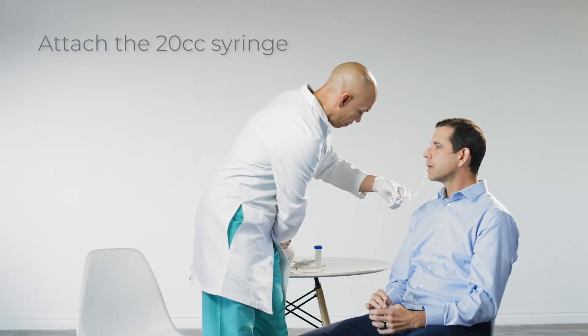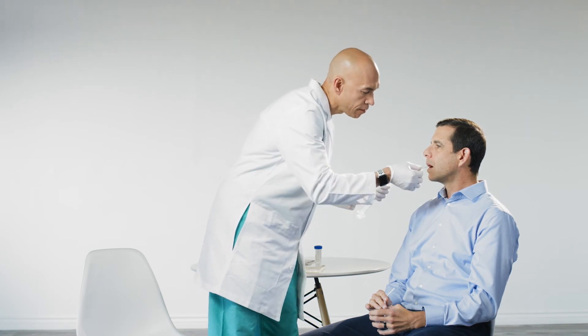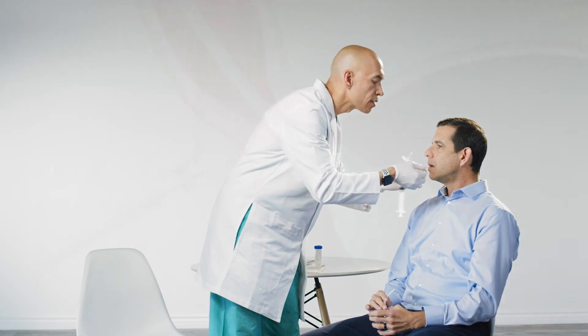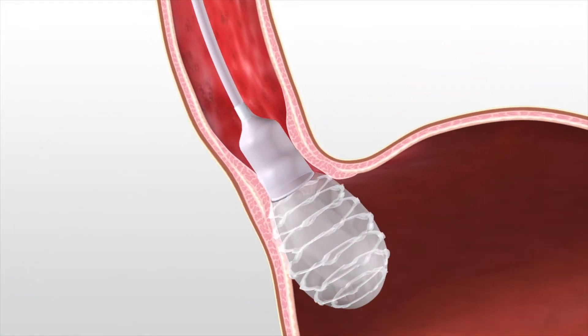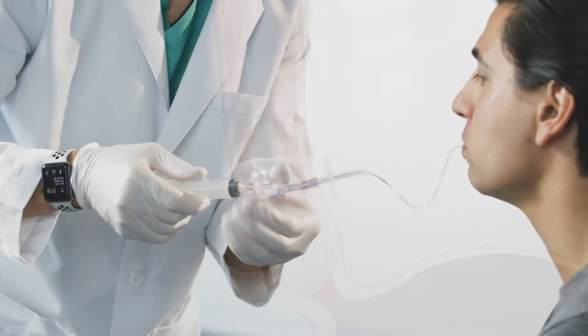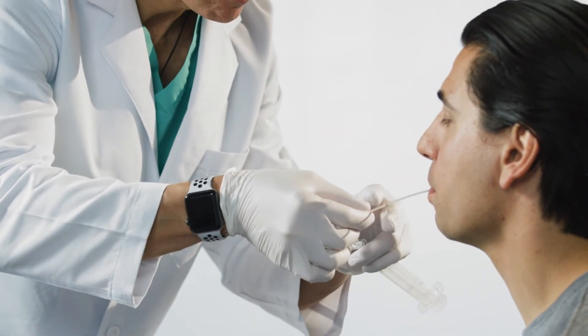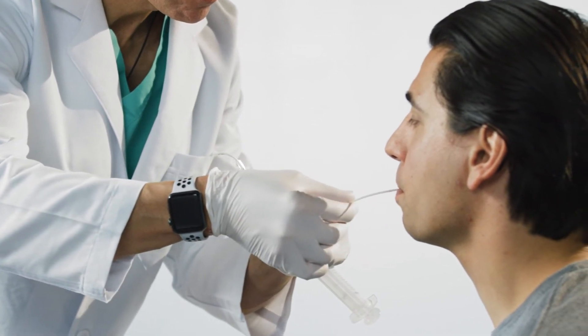Attach the 20 cc syringe securely to the lure fitting. Very gently, pull back on the catheter until a slight resistance is felt, indicating that the balloon has reached the LES at the GEJ. At this point, note the distance markings at the teeth, which will serve as the starting point for cell sampling in the esophagus.